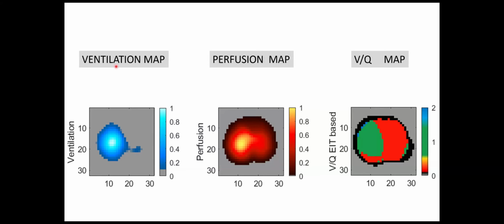And then we tested the specificity of this impairment in perfusion, for instance, doing a bronchial occlusion, mimicking pneumonia or some blockage by secretions. We see an impairment in ventilation, and a small impairment in perfusion caused by hypoxic vasoconstriction. We were afraid that we could falsely detect a pulmonary emboli because of this block in perfusion caused by hypoxic vasoconstriction.